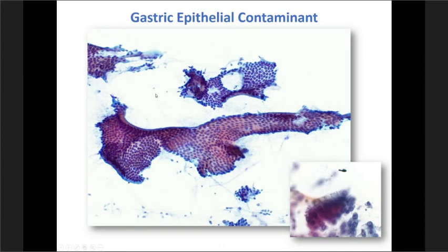The background will definitely help. Remember that if this is indeed a sampling of a mucinous neoplasm, there will be a lot more mucin in the background, which will be more thickened and more inspissated, and the cells will show you a lot more stratification of the nuclei than this nice honeycombed appearance.